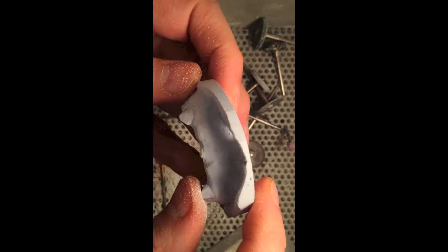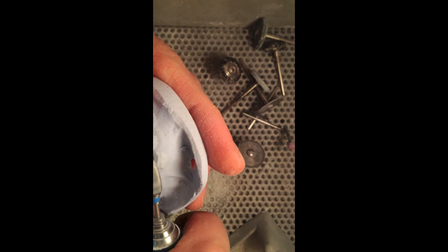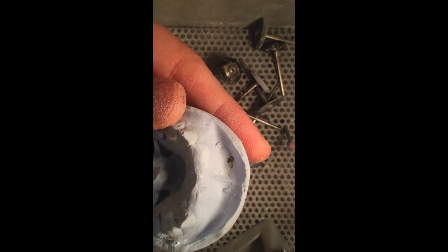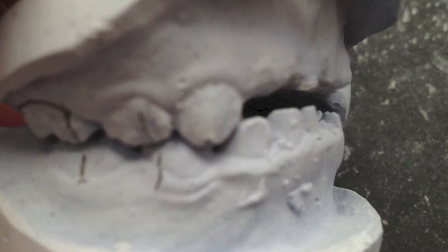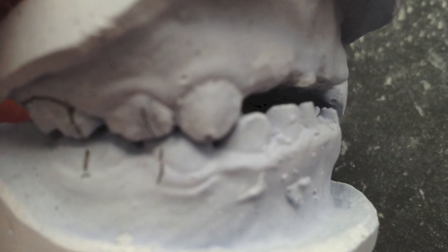As I'm finishing this up I need to explain something — I didn't record me fitting the bands on this. That's a whole other episode and a whole other video that will take a while to do, so I skipped all that. You'll notice when I start bending the wires that the bands already fit, and I'll try to get that up as soon as I can.